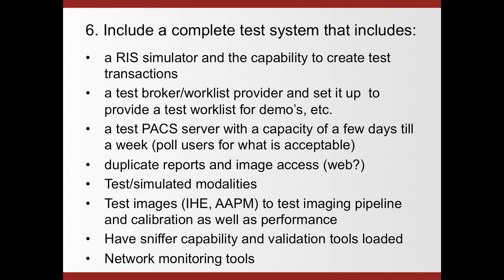You want lots of test images to test the pipeline, and test images are available from Integrating the Healthcare Enterprise. Just as an example, to test your digital mammography system, there are lots of test images that give all the different views with all the different view code modifiers. It would actually take probably days to simulate all these images, and they're all available, as well as from the AAPM for testing your calibration and your monitor performance.